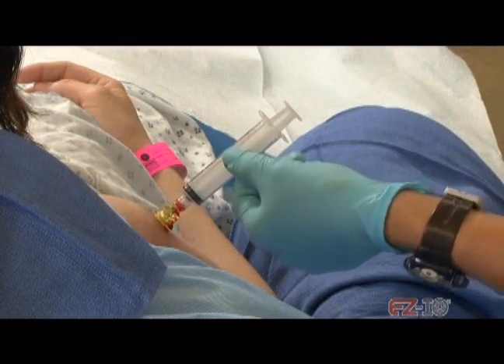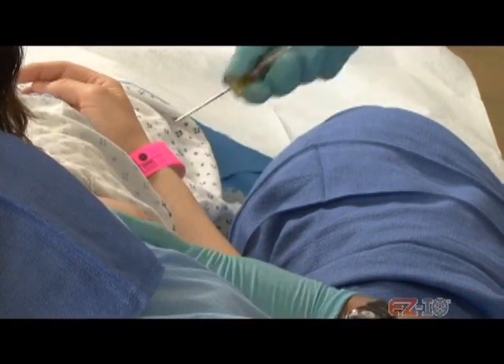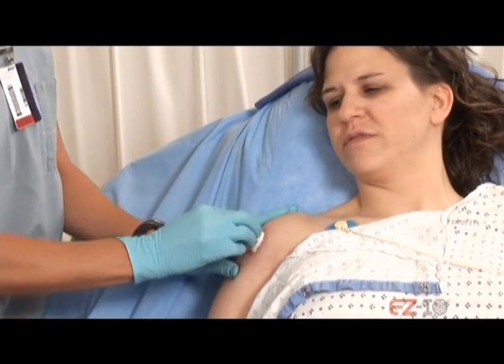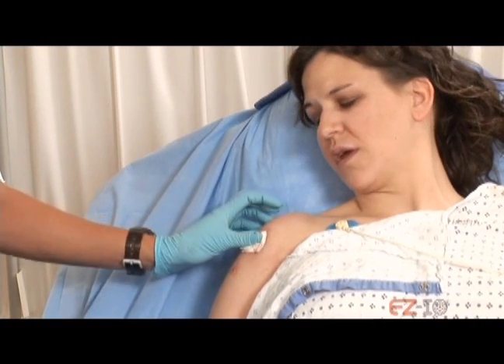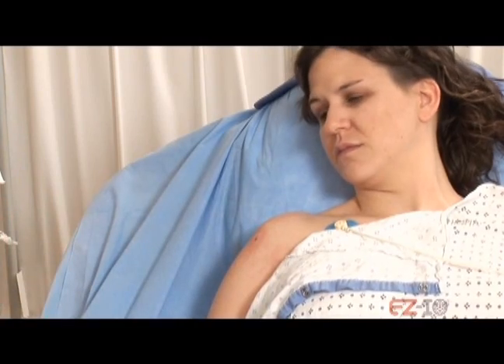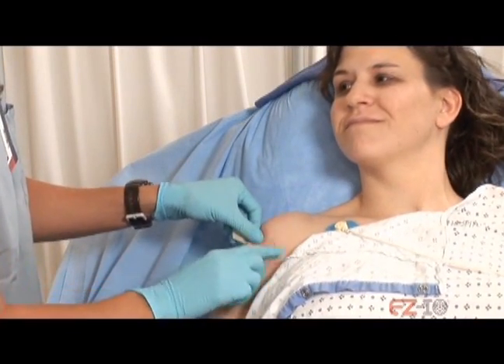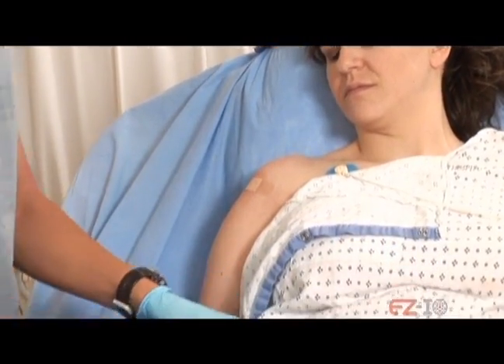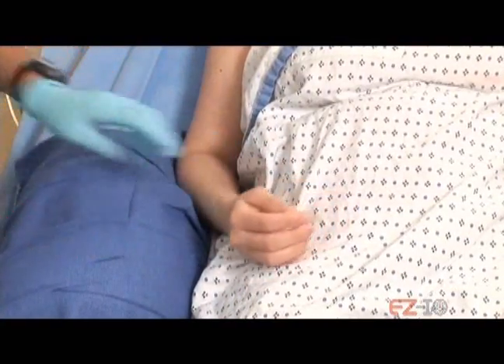So I'm just going to pull this back, okay? Ready? 1, 2, 3. All right. How you doing? Good. All right. Okay. Now we'll just get that wristband off you. There we go.